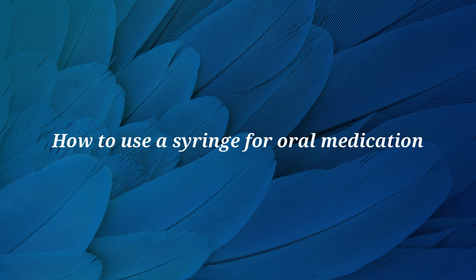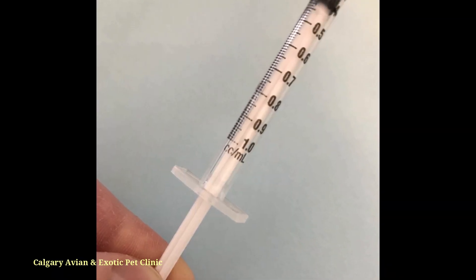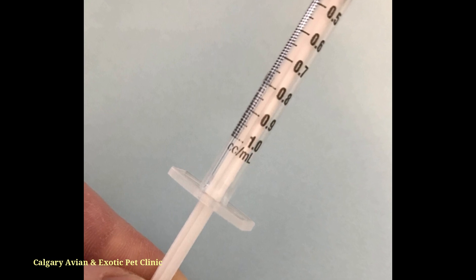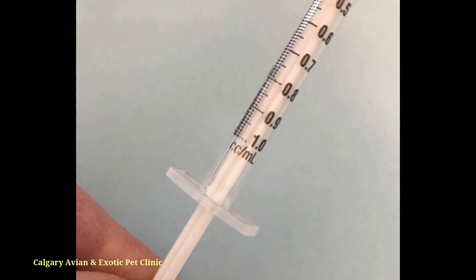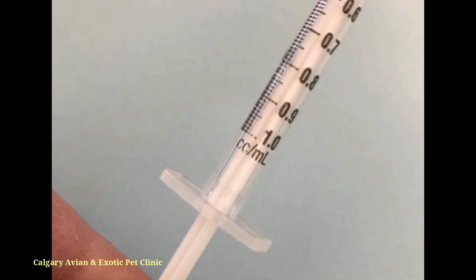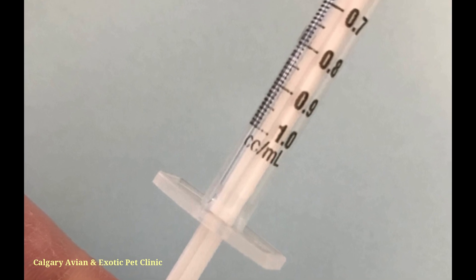Understanding how to use a syringe is important to ensure that your pet receives the correct amount of medication. You may see either the letters CC or ML on the prescription label or on your syringe. CC stands for cubic centimeter, which holds one milliliter. CC and ML are equivalent and can be used interchangeably because they stand for the same volume of fluid.